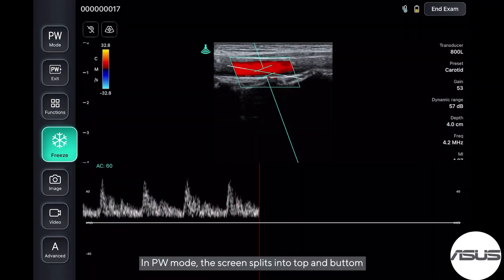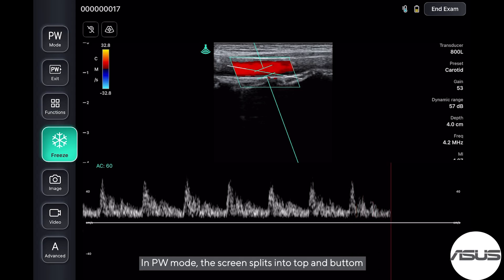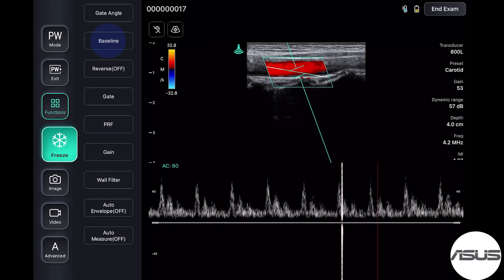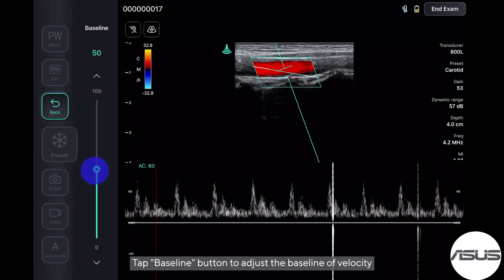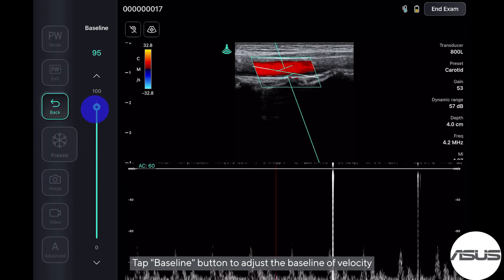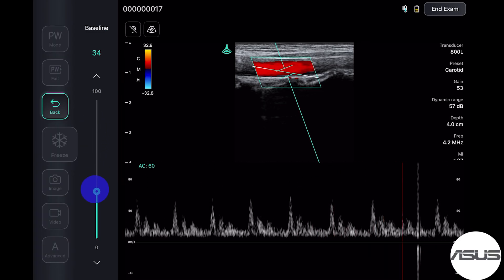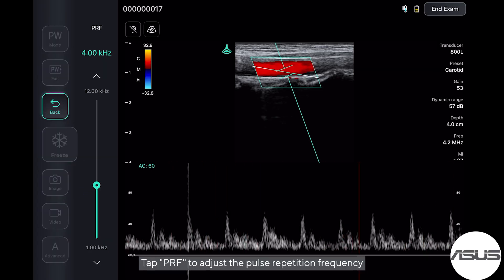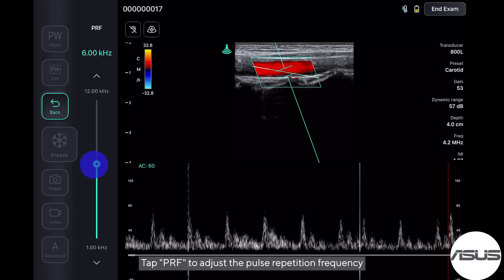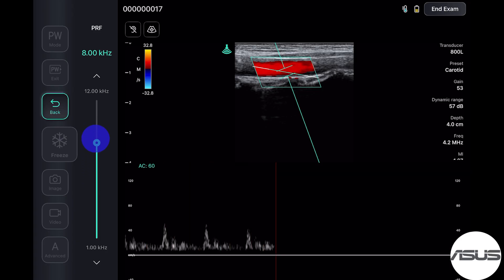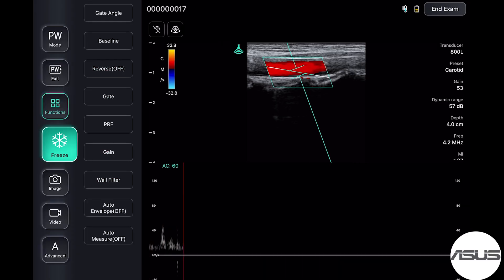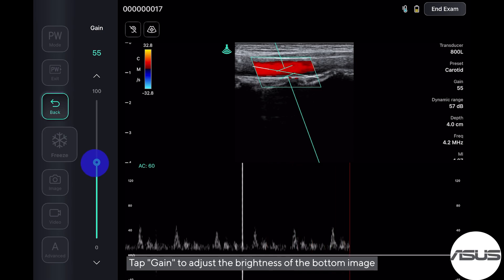Tap steering angle to adjust the steering angle. Once aligned, you're ready to enter PW mode and start acquisition. In PW mode, the screen splits into top and bottom. The lower graph shows velocity versus time. Tap the baseline button to adjust the baseline of velocity. Tap PRF to adjust the pulse repetition frequency.